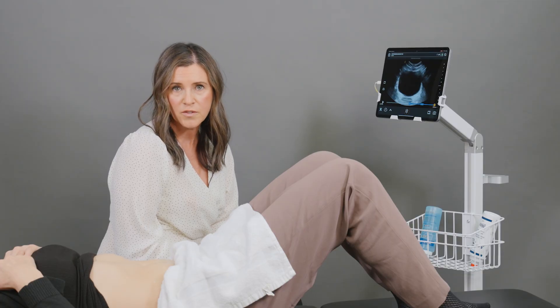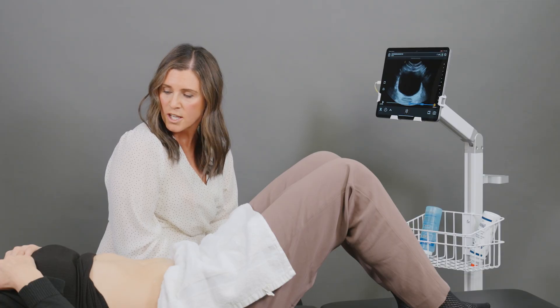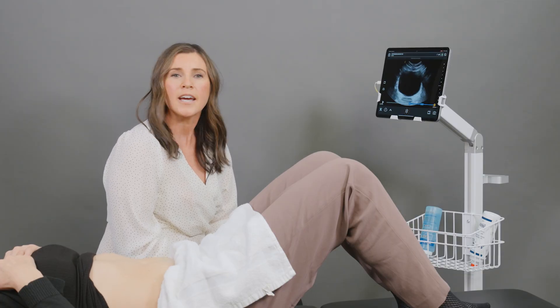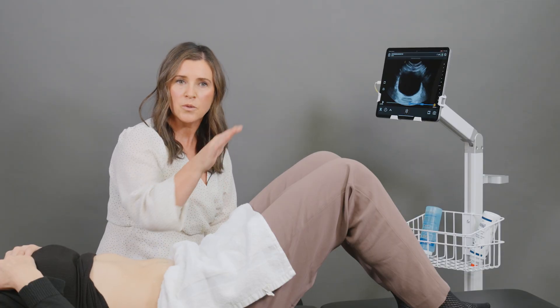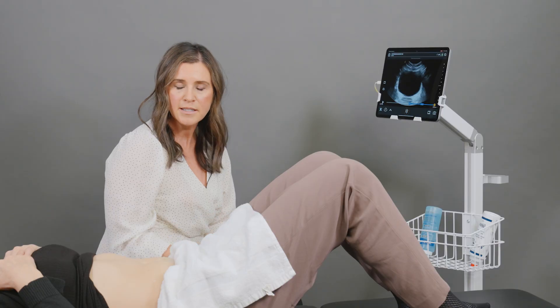We're going to start with a transverse approach. We're first going to get our client into a crook-lying position with their knees bent, and also making sure with a trans-abdominal approach to looking at the pelvic floor that the patient has a moderate amount of fluid in their bladder.